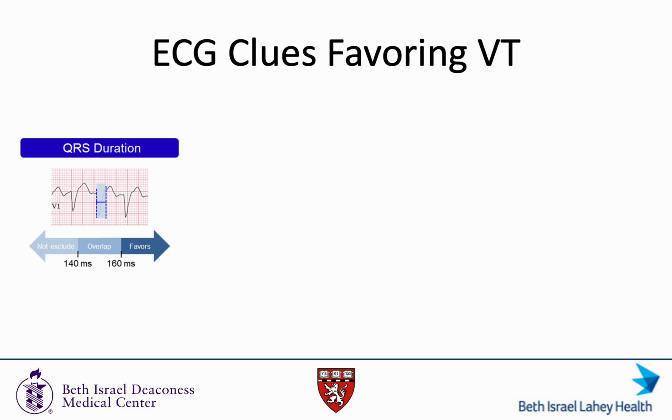As a side note, if a patient has a shorter QRS complex duration during their tachycardia than their QRS duration was on a previous ECG in sinus, in other words, if their QRS was wider before than it is on your current evaluation, that is a very strong clue that the patient is in VT. That almost always occurs in the setting of an abnormally wide QRS with an interventricular conduction abnormality during sinus rhythm.